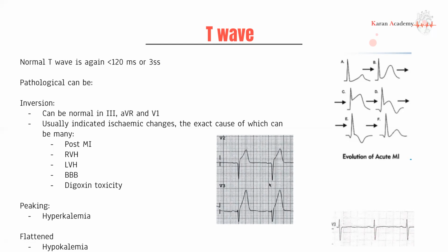Now, the question is, why don't we see these peaked T waves when we look for MI changes? Because this happens so quickly, it's almost unlikely you're ever going to catch this unless you already had an ECG attached while the patient had a heart attack.